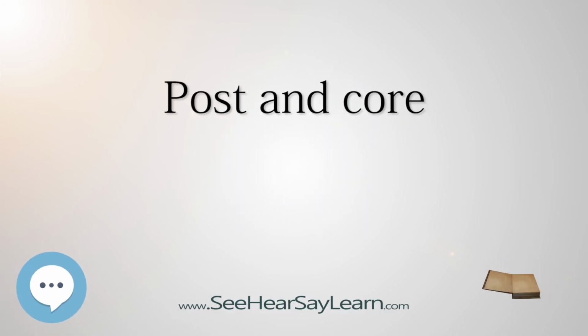A post and core crown is a type of dental restoration required where there is an inadequate amount of sound tooth tissue remaining to retain a conventional crown. A post is cemented into a prepared root canal, which retains a core restoration, which retains the final crown. The role of the post is firstly to retain a core restoration and crown, and secondly to redistribute stresses down onto the root, thereby reducing the risk of coronal fracture.